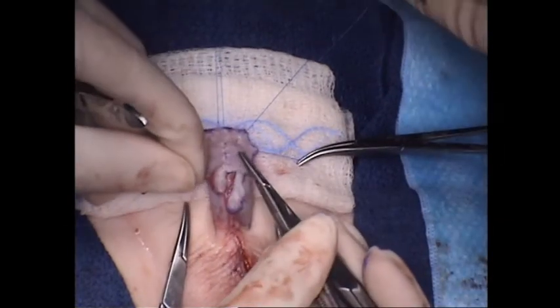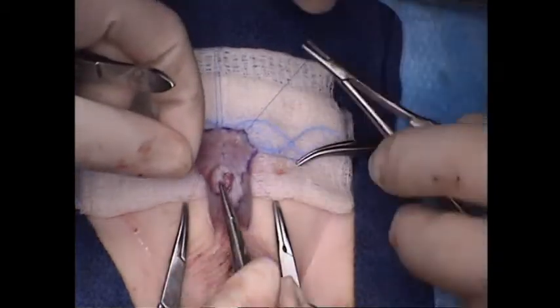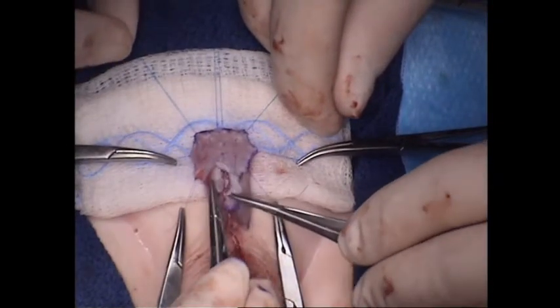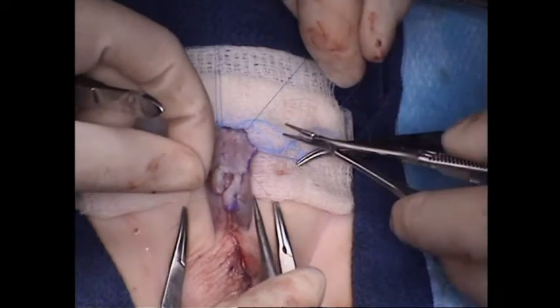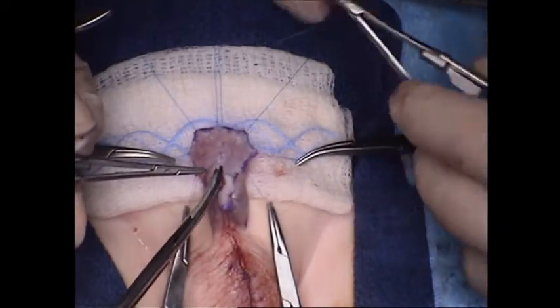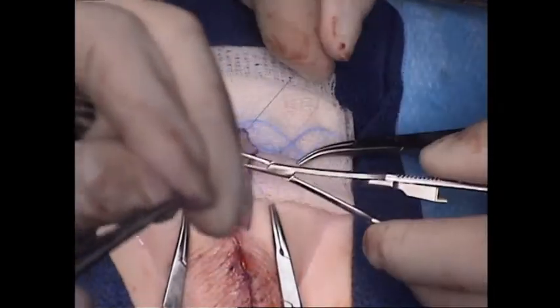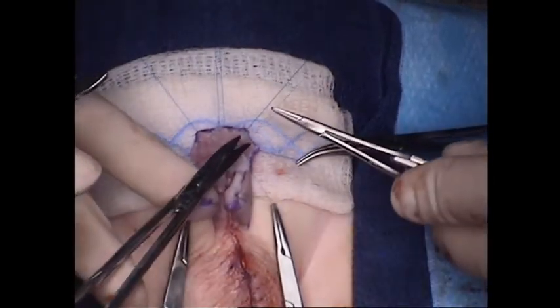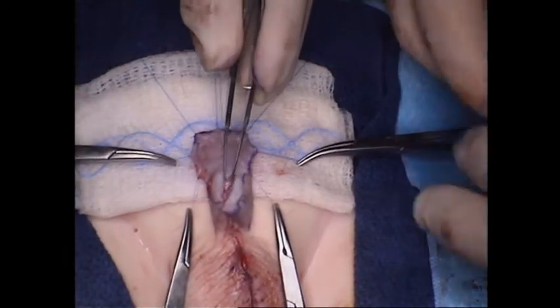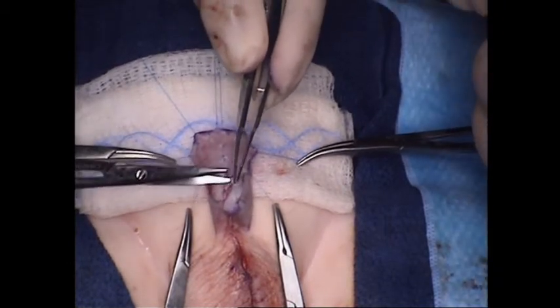So we've used the STAG technique for reoperations in men who've had as many as 20 failed repairs, and yet the grafts will heal reliably against the corpora. We cut off all the visible scarring that we can, and then we just lay the graft on top of it. We don't put other tissue material such as tunica vaginalis or dartos under our grafts. That defeats the purpose of having the graft against the corpora, so that we get a uniform, smooth, well-vascularized neourethra at the next stage.